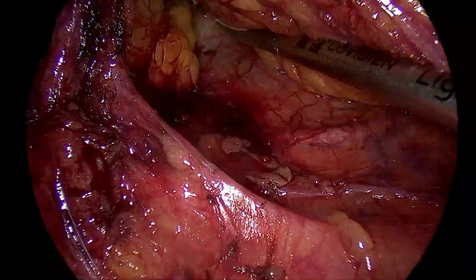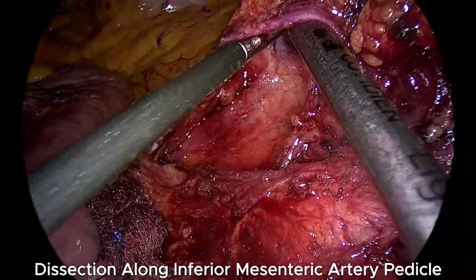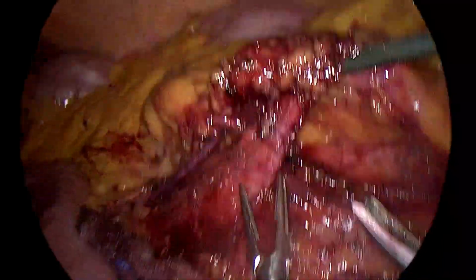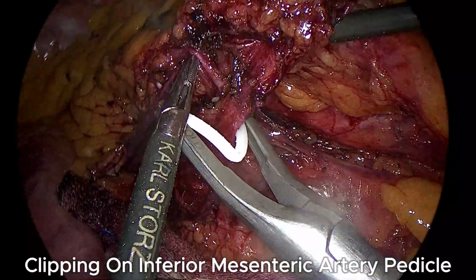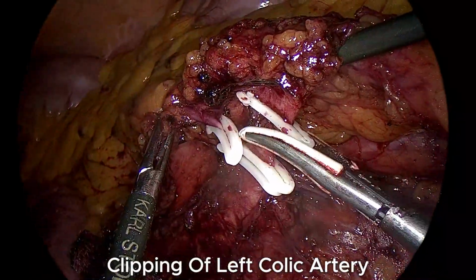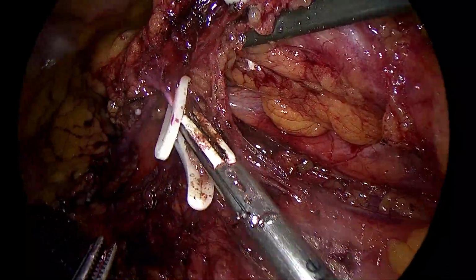Here as you can see we are doing medial to lateral mobilization, then dissection around the inferior mesenteric artery pedicle, then after properly dissecting the inferior mesenteric artery and left colic artery, both vessels were clipped and divided. As you can see we are clipping the inferior mesenteric artery and left colic artery, and we then divided both vessels, then we completed medial to lateral and lateral to medial mobilization of colon.